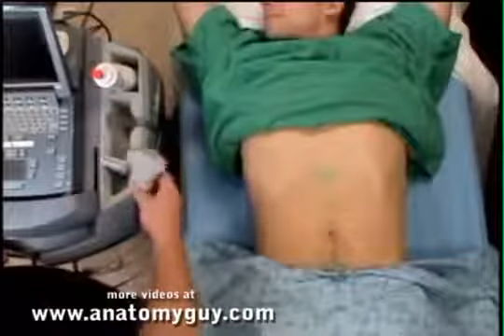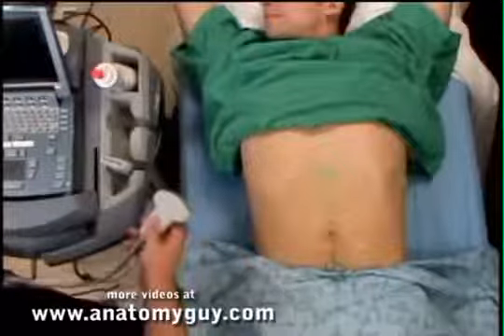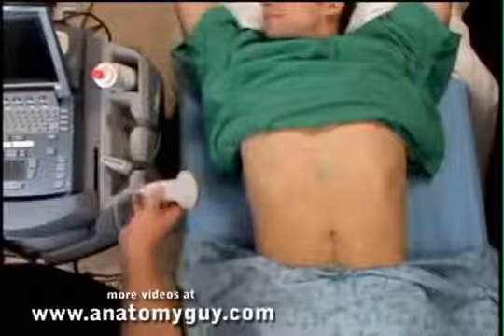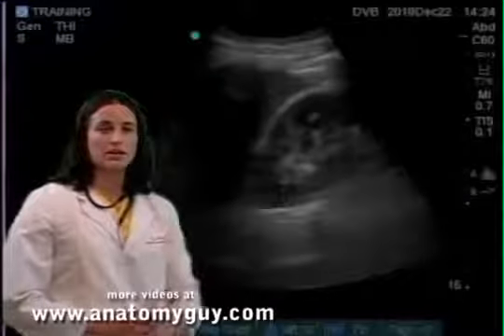For the FAST exam, the first area that we want to look at is at Morrison's pouch. The probe marker is placed towards the patient's head at the lateral costal margin, more inferiorly, to get a better look of the liver, which we will look at now. The probe marker position towards the head is actually indicated by this dot here on our screen.